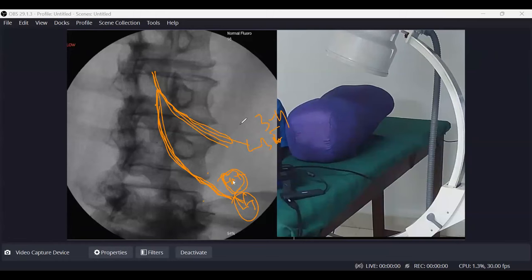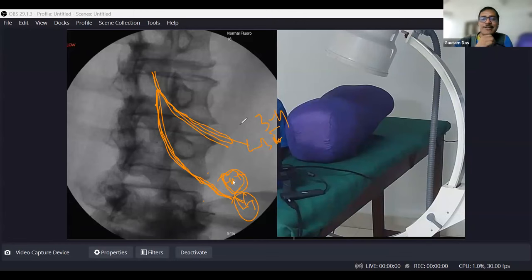Okay, sir. Got it. It is the same nerve root. At some level it is called exiting, at some level it is called traversing. Now, if your needle is here at the Cambin's triangle approach, you are non-selectively blocking both. But when you are giving it here, you are selectively blocking either the dorsal root ganglion or this nerve root. Clear to everybody? Yes, sir.